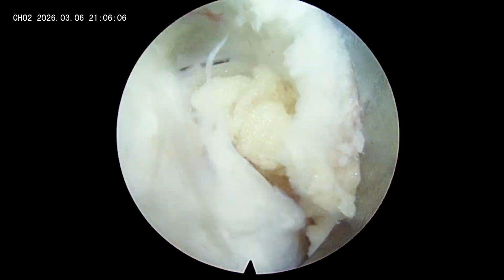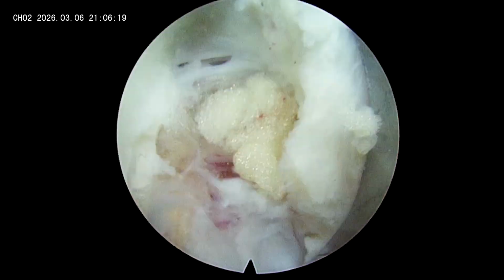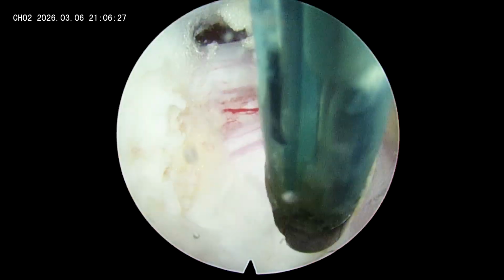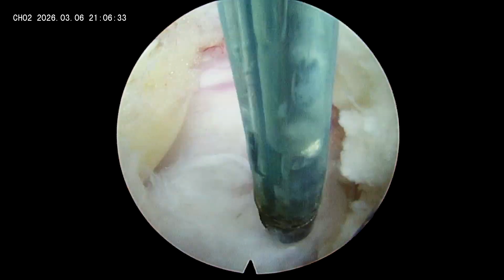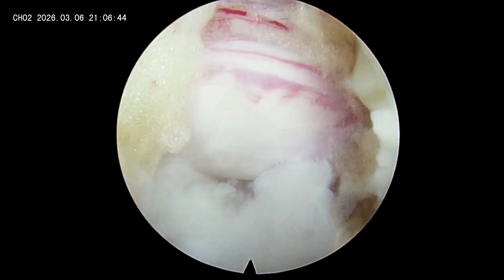I'm just pulling it. In a young patient, the disc fragment is the sticky type, so it is very unlikely that you will get the entire disc fragment in one go. You have to remove such disc fragments bit by bit, in piecemeal. This is a very young patient, so I'm expecting the same. It won't be a single fragment; it will be sticky, multiple fragments. Here I am shrinking the extruded fragment so as to get clear access and vision.